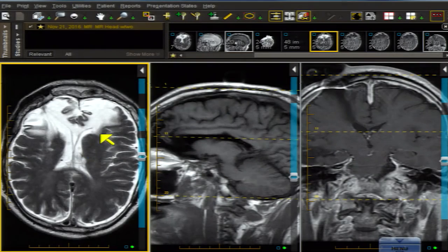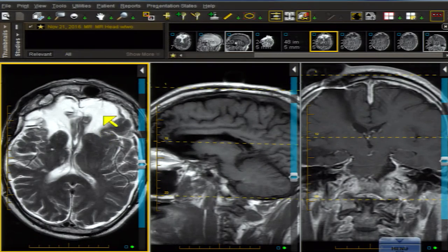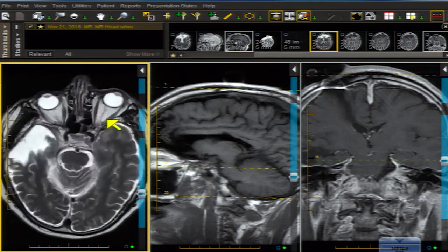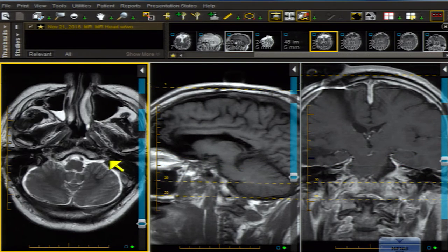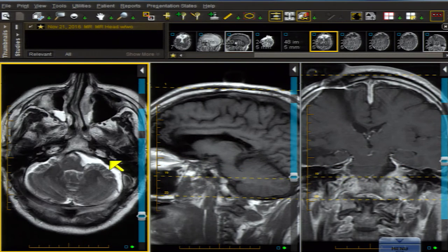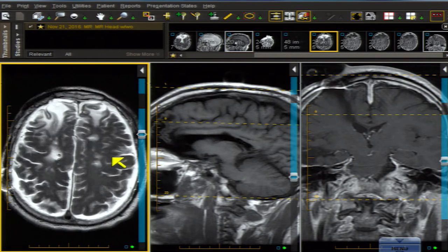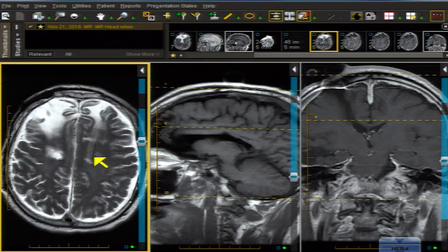This is a 52-year-old man who is in a deceleration injury, and I am confident that all of you are focused on the bifrontal encephalomalacia from prior trauma. Let me scroll a bit — take your time and have a look as I scroll up and down and see what catches your eye. There are multiple areas of white matter signal alteration.